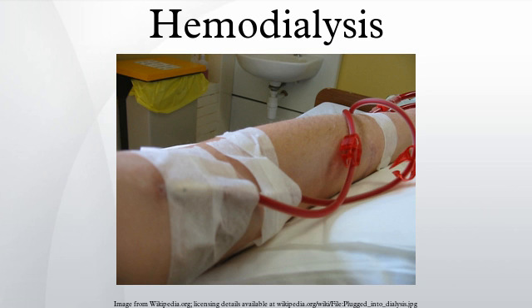Hemodialysis treatment and complications: perform a head-to-toe physical assessment before, during and after hemodialysis regarding complications and access security. Confirm and deliver the dialysis prescription after review, and note updated lab results. Address any concerns of the patient and educate the patient when recognizing a learning gap. Medication management and infection control practice: collaborate with the patient to develop a medication regimen. Follow infection control guidelines as per unit protocol.